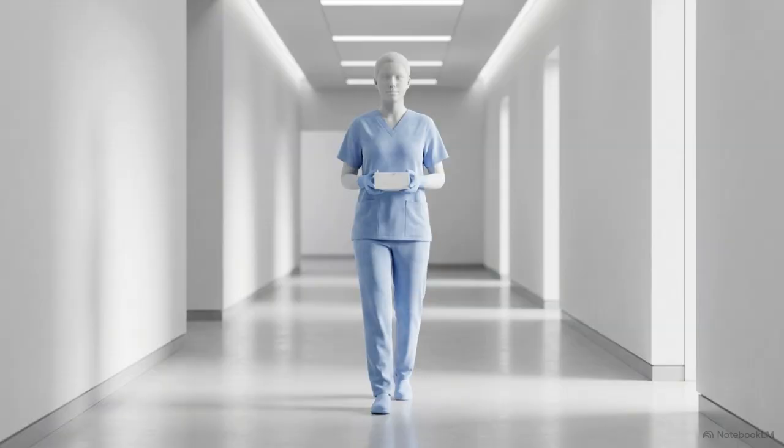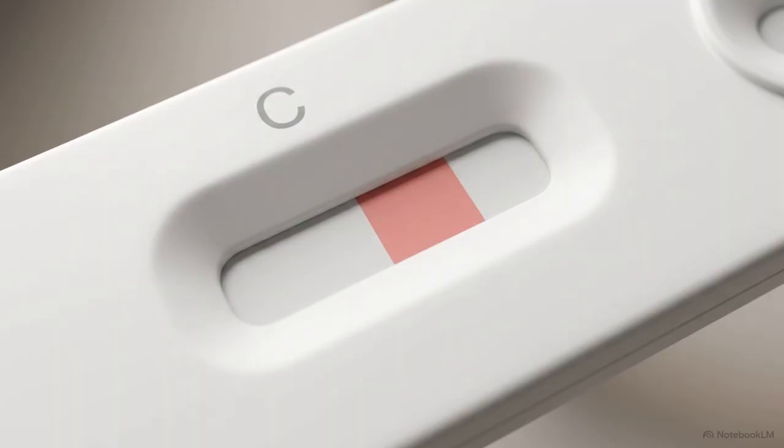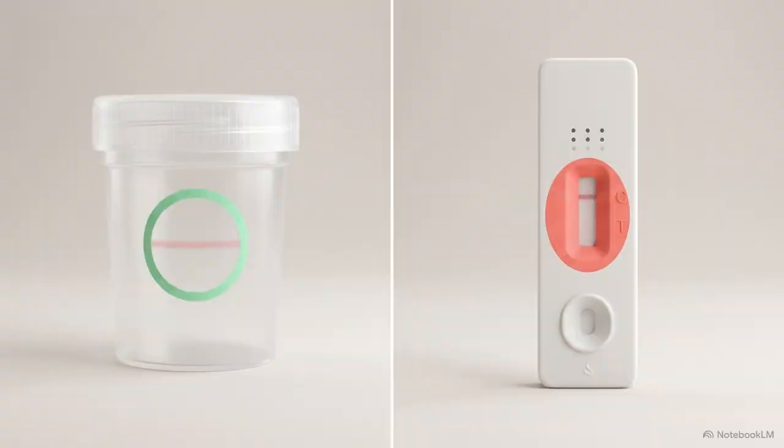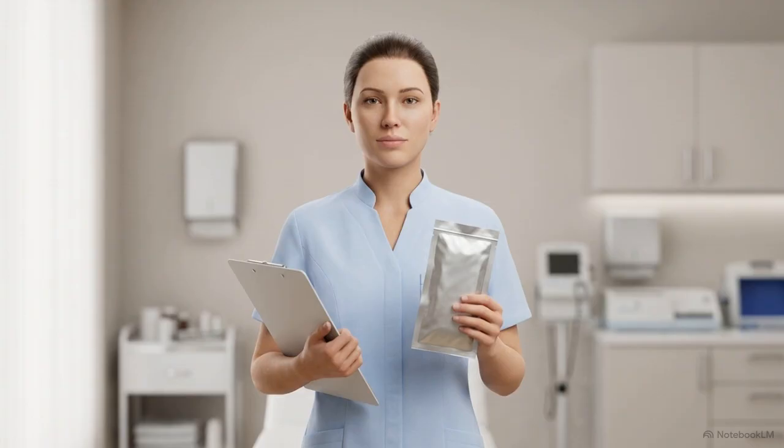Back on the floor, the process becomes second nature when you stick to the framework. Always adhere to exact manufacturer timings. Prioritize the control line above all. Know your faint line rules, and document every single variable. You now have the exact procedural steps needed to run point-of-care tests independently across our programs.